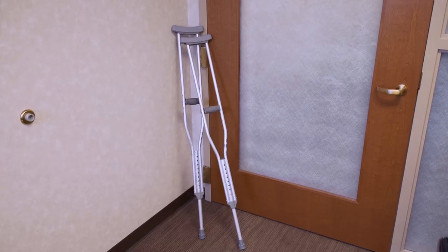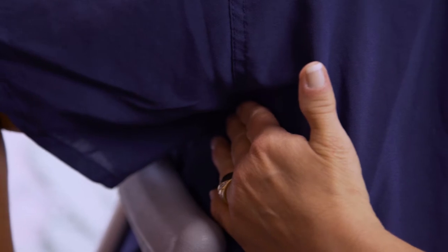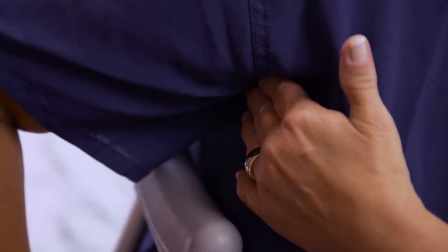Every crutch is adjustable to your height and arm length. The pads on the top should be about two to three fingers' width from your armpits, so as to avoid restricting blood flow.